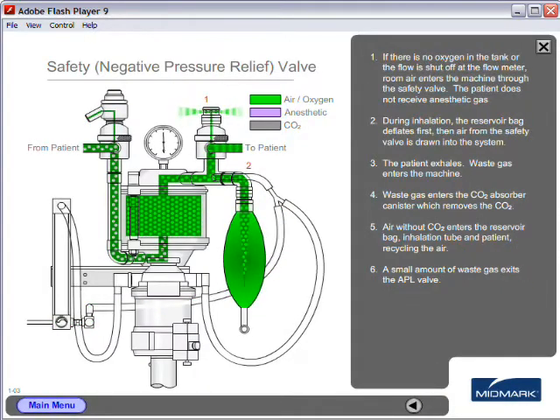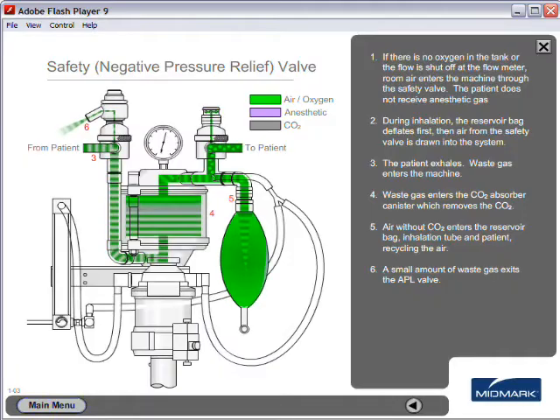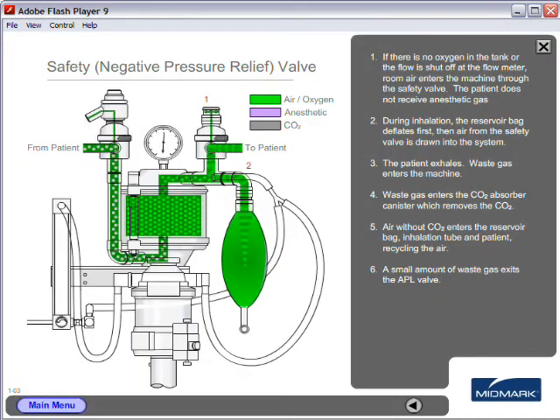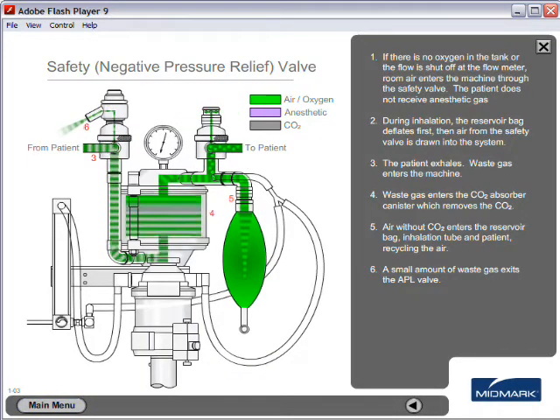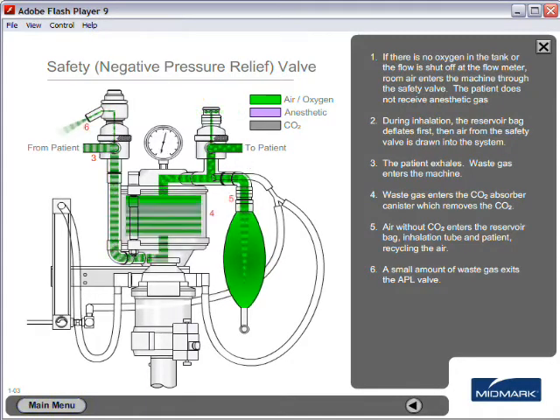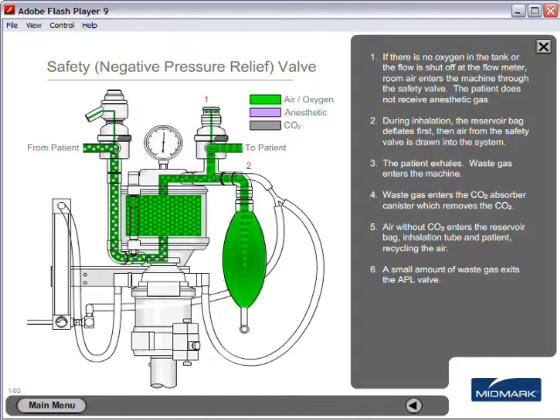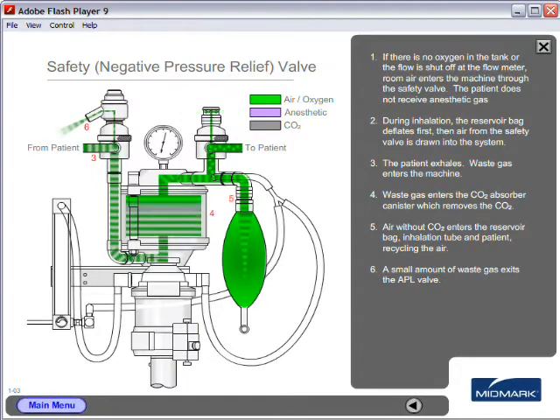Safety valve. If there is no oxygen in the tank or the flow is shut off at the flow meter, room air enters the machine through the safety valve. The patient does not receive anesthetic gas.